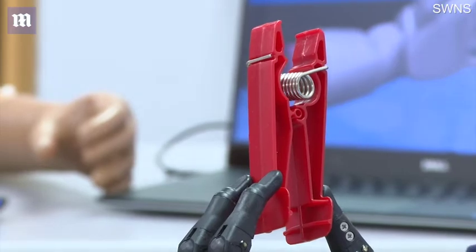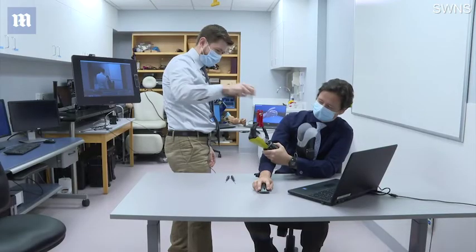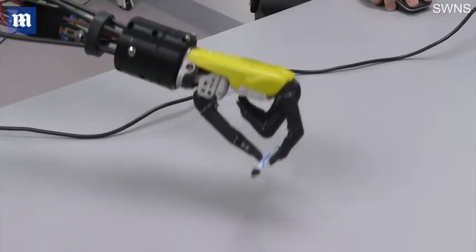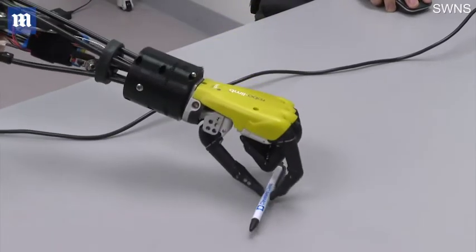Now I'm just sitting there not doing anything — you pull on the cord and it vibrates, and in my head it feels like I'm closing the hand. They feel as though their hands are moving even though they don't have a hand, and they feel as though their fingers are touching things even though they don't have fingers. And the interesting thing is that when we put all of these systems together, their brains actually feel like the hand is human.